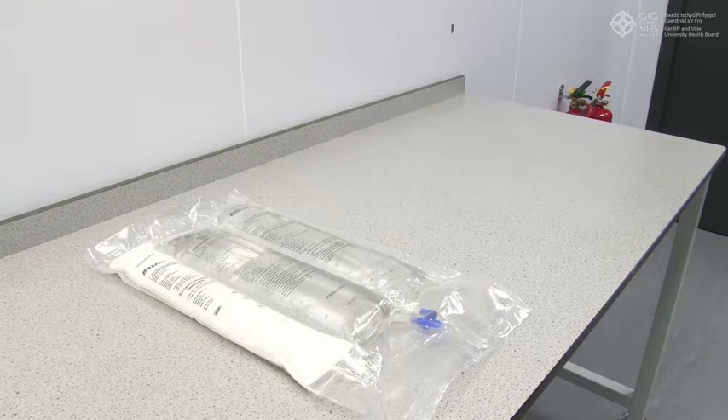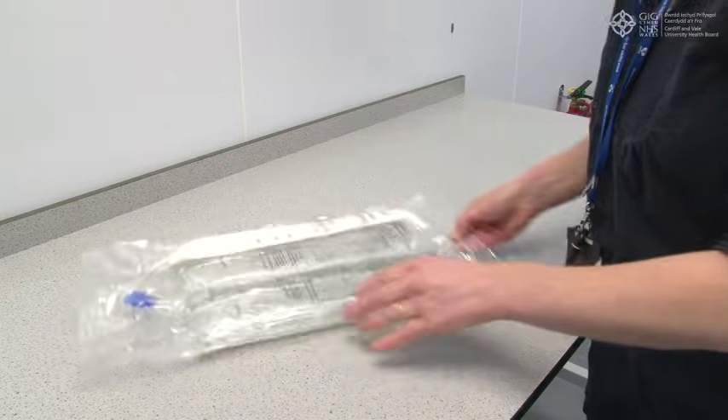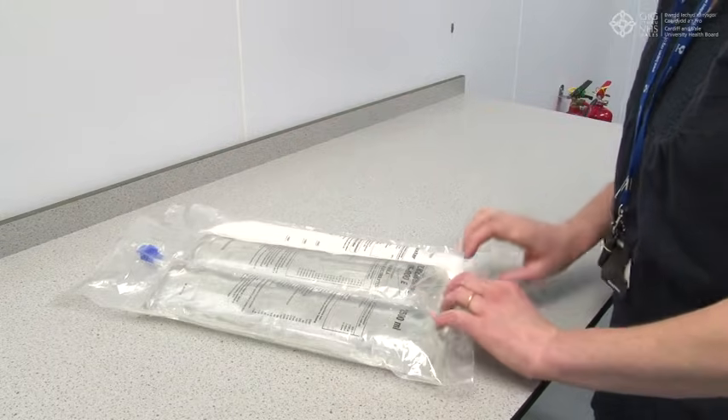We recommend keeping the outer wrapper on in case of any leakage. Place the bag flat on a horizontal and clean surface with the handle in front of you. Lift the hanger area to remove solution from the upper bag.